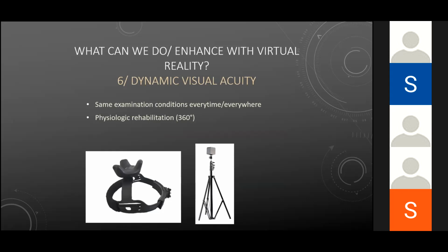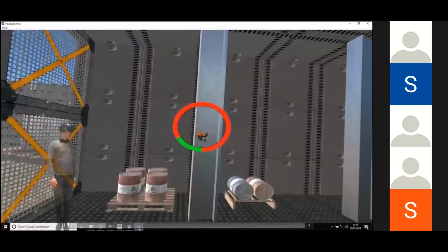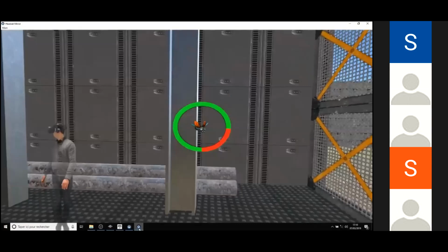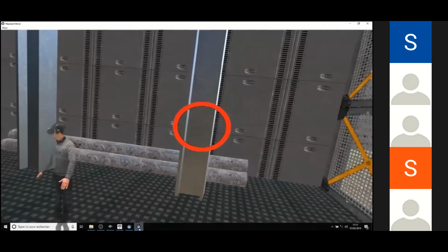See, it's actual vestibular stimulation as you have head movements. This one as well is even more effective standing, but you can start seated, then standing, then being on foam. So you see, you can set the difficulty, of course, that's quite difficult with really fast head movements and trying to maintain balance. So again, VR is not only about visual stimulation, but also vestibular stimulation with that kind of exercises. There's quite a lot to do with actual head movements.